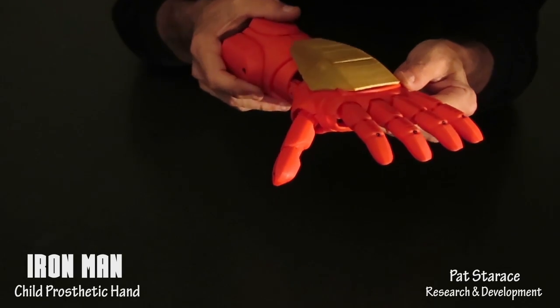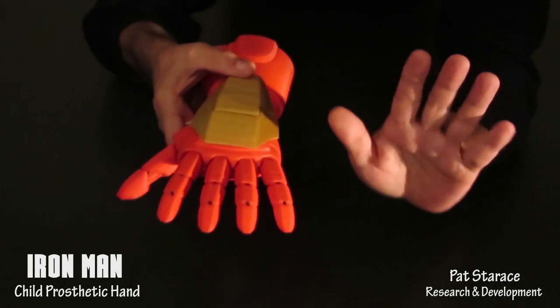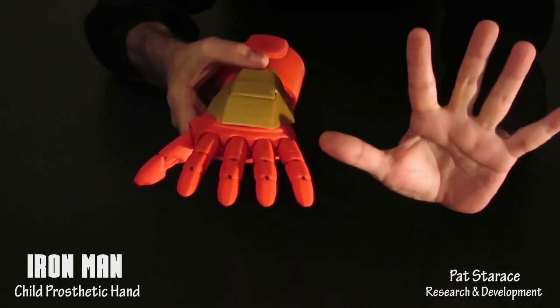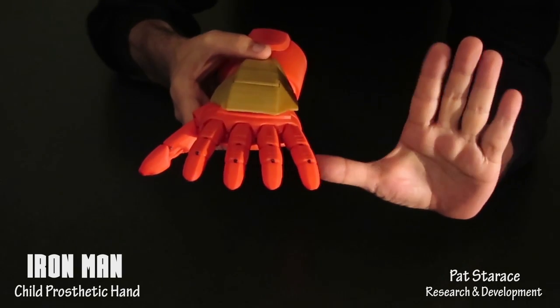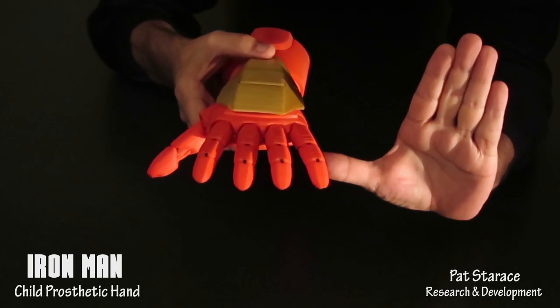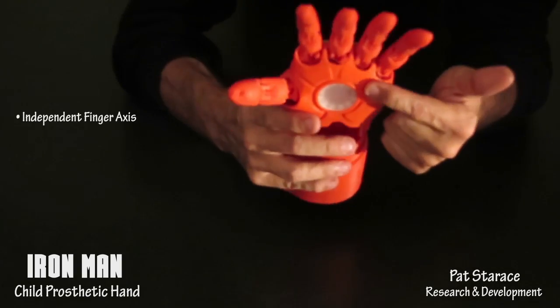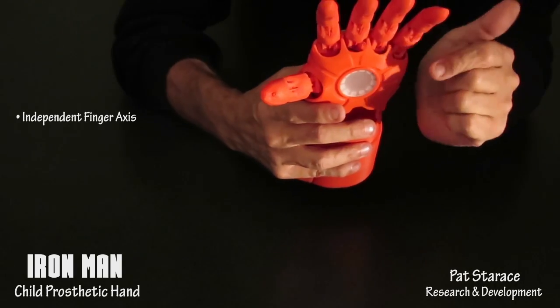Now comes the next reason why the fingers are slightly spread. When Iron Man makes that classic pose with his hand held out, fingers spread and the thruster glowing, if the fingers weren't spread, it wouldn't have the same effect. Creating a hand with independent axes for each finger is more difficult, but well worth it for the total effect.